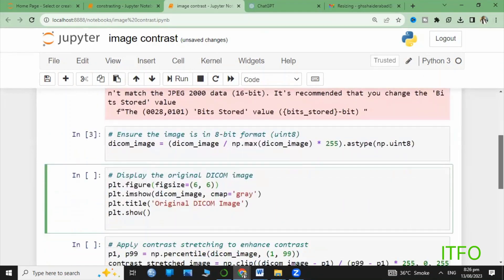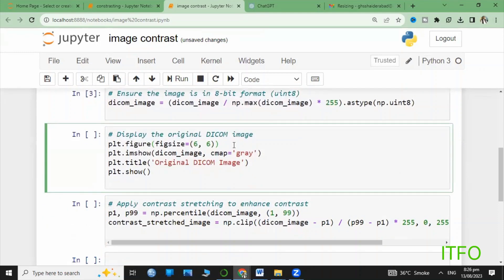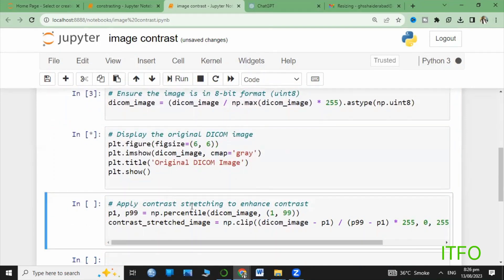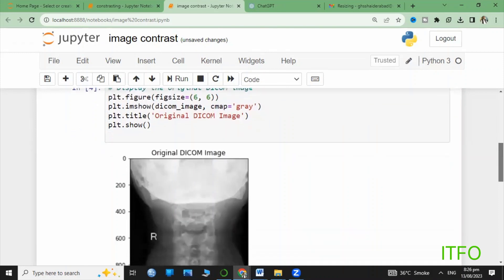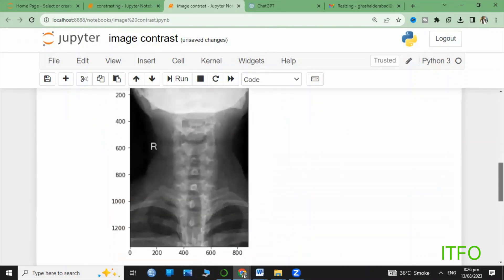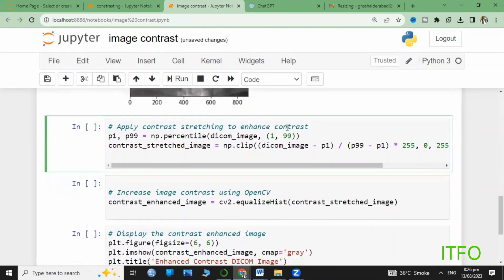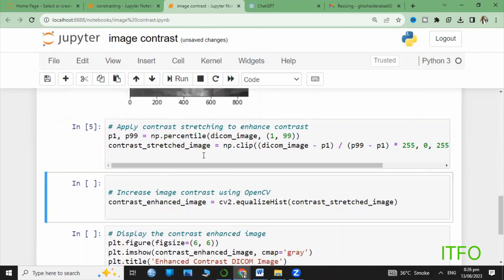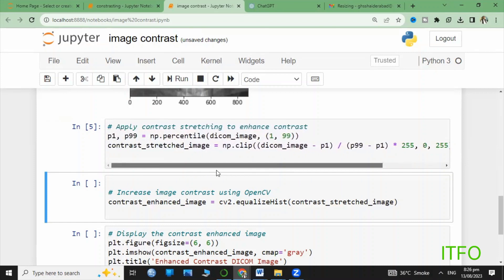Here on the screen, in the first code we use the astype function to convert it into 8-bit form before going further. Next, we apply contrast stretching to enhance the contrast.